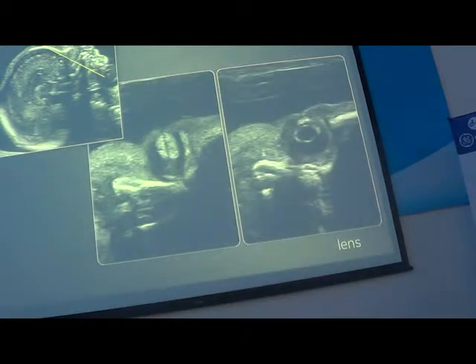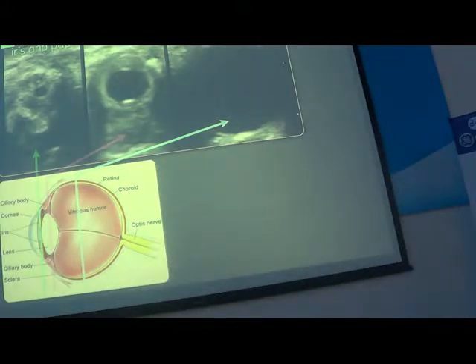And with two different sections, one is superficial with the eyelids, and one is deeper with the lens. Here are two different sections: in the superficial section we see the eyelid margins, and in the deeper section we see the lens. And here, the eyes with different sections, with the orbits. Here are the eyes with different sections. This section goes through the eyes. The lens. And iris and pupil.